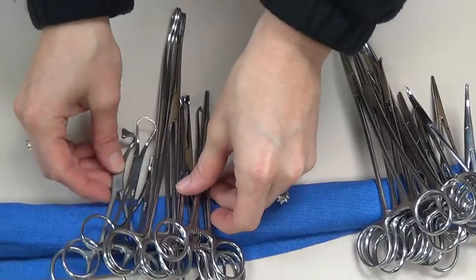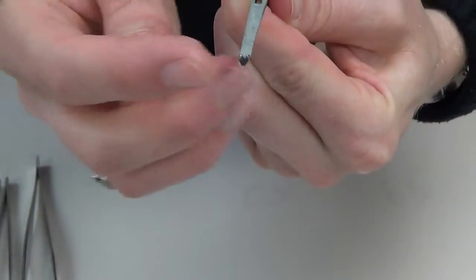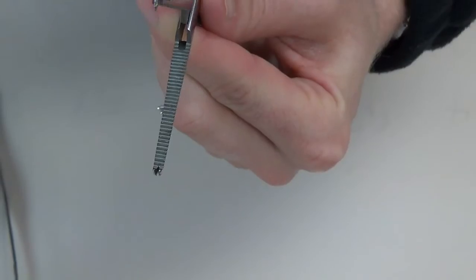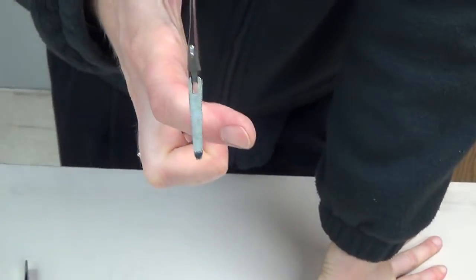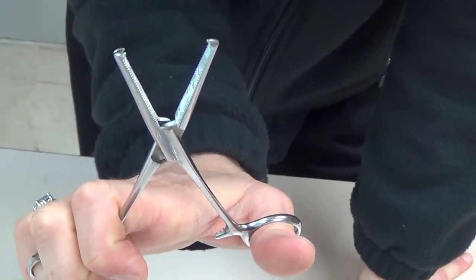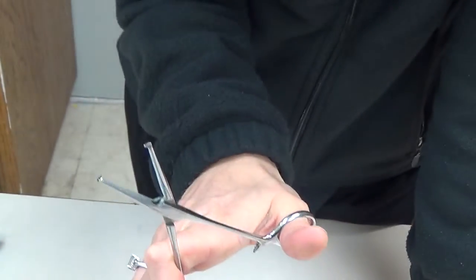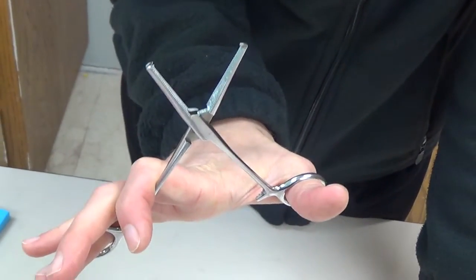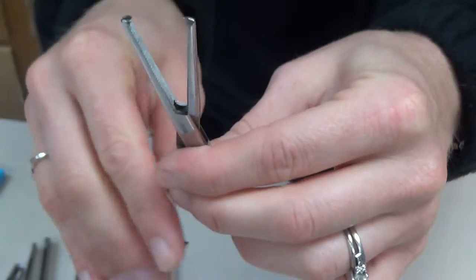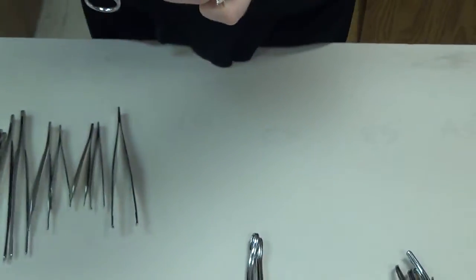Now we have our grasping types of instruments. The first is what we refer to as a Kocher. If you look at the tip, there are teeth — two teeth on one side and one on the other — plus horizontal serrations on the inside. We would never place this on fine, delicate tissue like bowel because it will cause damage. It's used only on muscle fascia, tendons, or specimens being removed. It's very commonly utilized to grasp thick, heavy tissue to lift or manipulate it throughout the case.